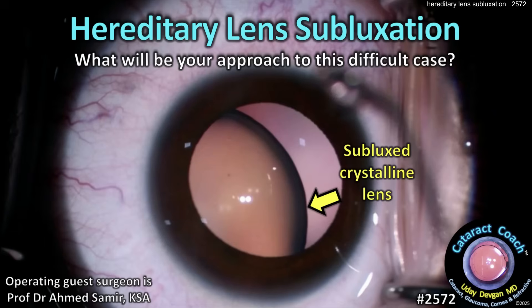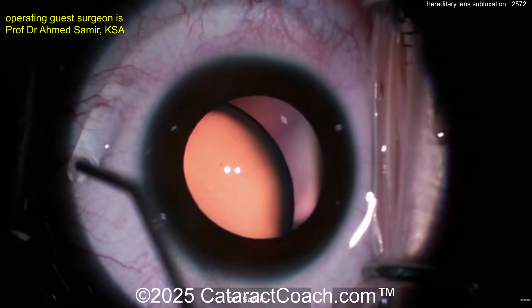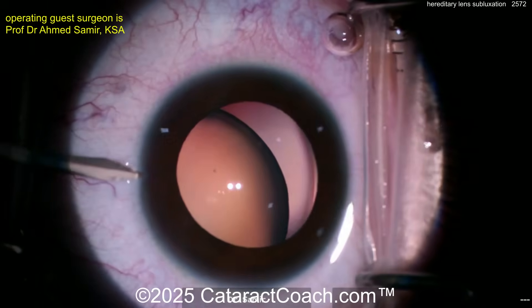Cataractcoach.com: hereditary lens subluxation — what's going to be your approach for this difficult case? The patient has a lot of dislocation of the crystalline lens, not much cataract formation, a young patient.